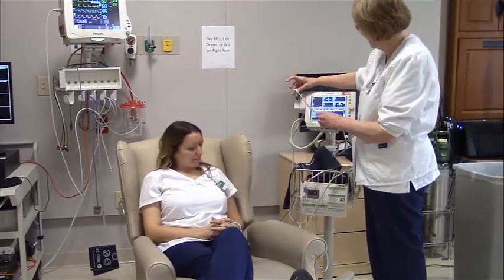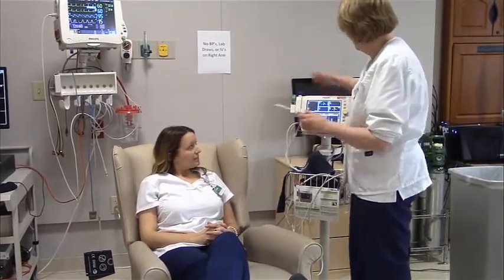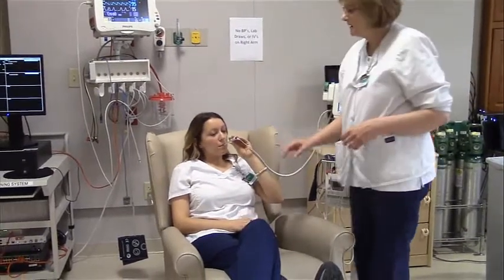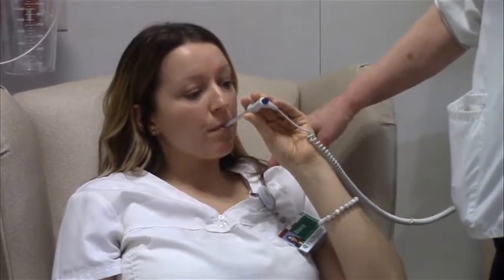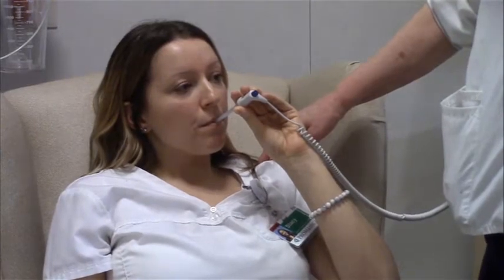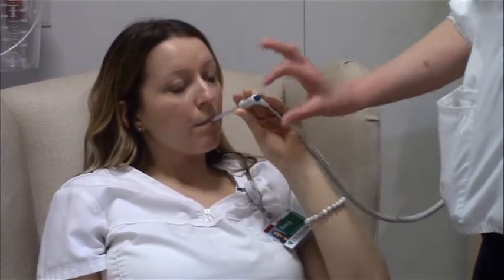Okay, the thermometer is not working. There we go. And so as I have that at the base of the tongue, I am watching my patient's rise and fall of their chest. Again, I want to look for 30 seconds and actually count the rise and fall as 1, rise and fall as 2, and we're going to keep doing this for 30 seconds, multiplying it by 2 when I get my results.